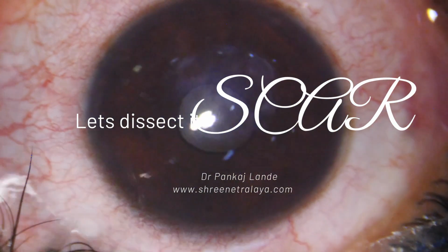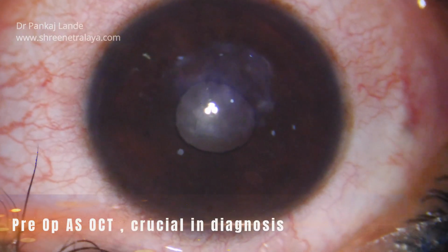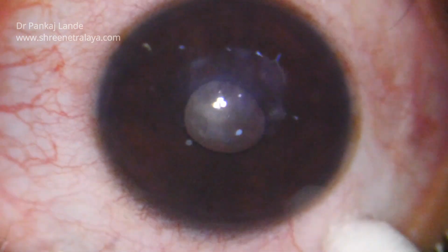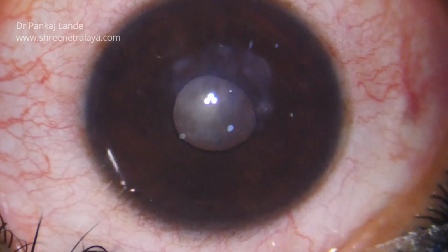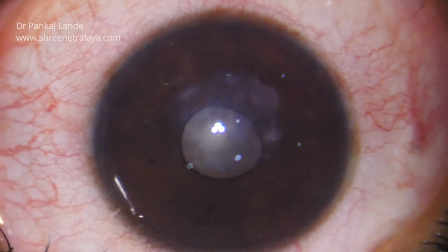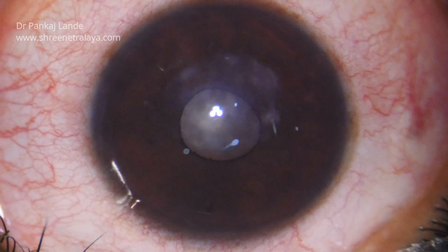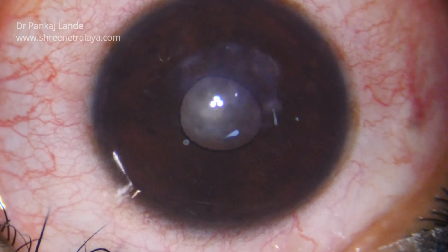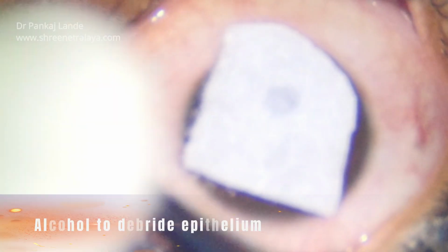In this very interesting video, we will see how to dissect an anterior stromal scar which can be easily diagnosed with a readily available machine in most of the clinics nowadays, that is anterior segment OCT, which has a very crucial role in diagnosing these cases. This particular patient is a 36-year-old female who had a trauma in her childhood and was having a vision of 6/36 following it since last so many years.